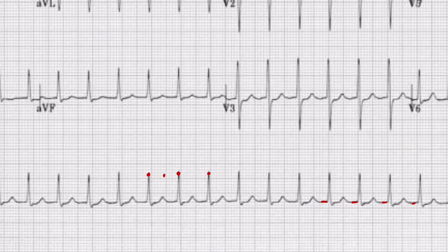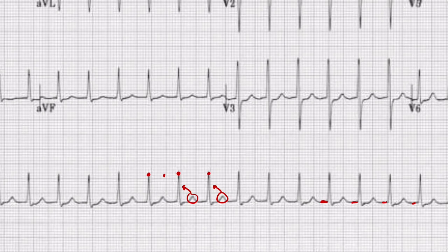Next we're going to look for P waves. You might be tempted to think that these are P waves, but these are actually part of the ST segment from the previous QRS complex. If we look over here, we actually don't have any P waves in front of these QRS complexes — so no P waves. That also means there is no PR interval since there's no P wave.